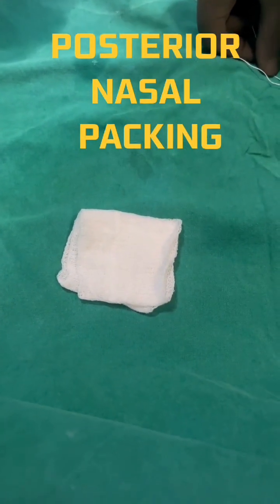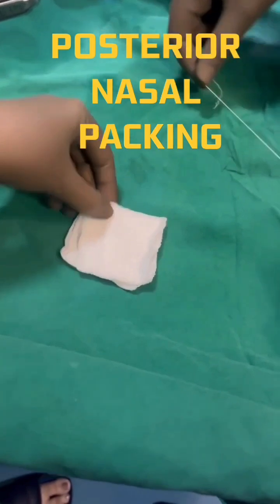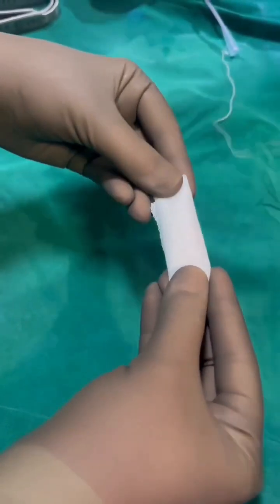We will demonstrate how to do a posterior nasal packing in case of posterior epistaxis. We take a gauze piece, make a bolster dressing for the nose, rotate it, and three threads are to be tied.